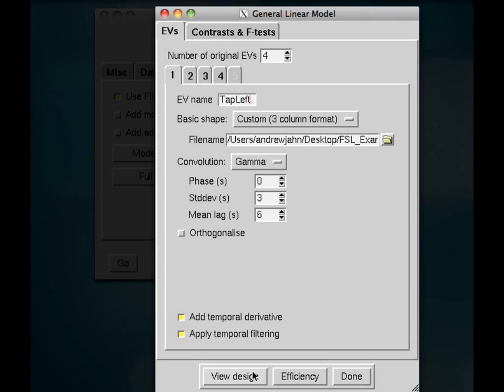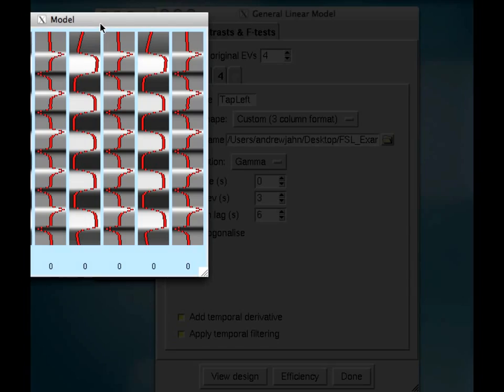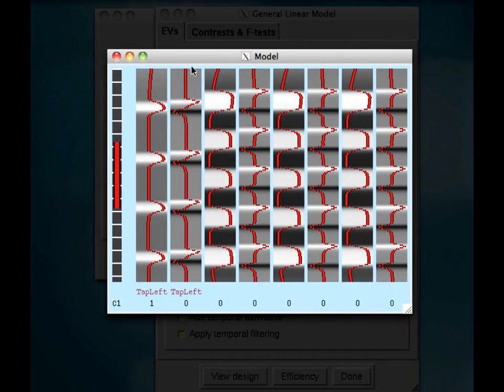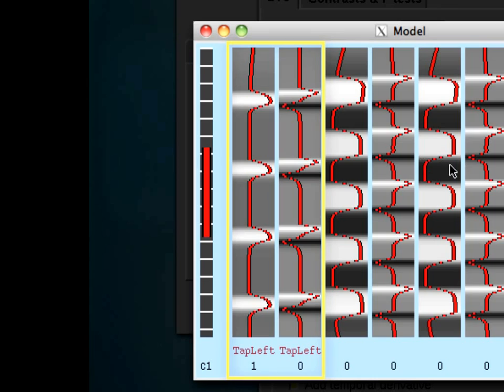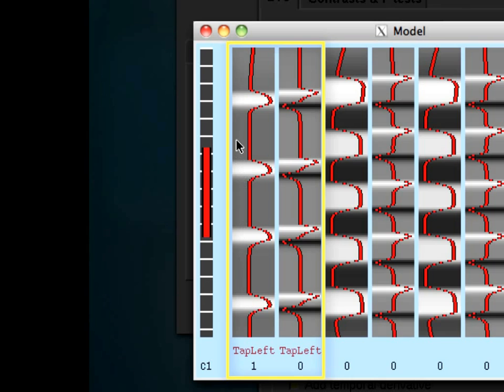So we've only entered in one EV, but I'm going to go ahead and view the design right now. So just focus on these first two. These last aren't going to mean anything because we haven't filled in anything yet. But for tap left, you can see that at each of the times where the tap left condition was on, you see this whiter, brighter shading here. And it lasts for 15 seconds. And some time elapsed, and then it was on again for 15 seconds. Some time elapsed. And it's been convolved with the canonical gamma HRF right here. So just looking at your timing files, this pattern should make sense. I know that they were equally spaced out and that they lasted for 15 seconds.